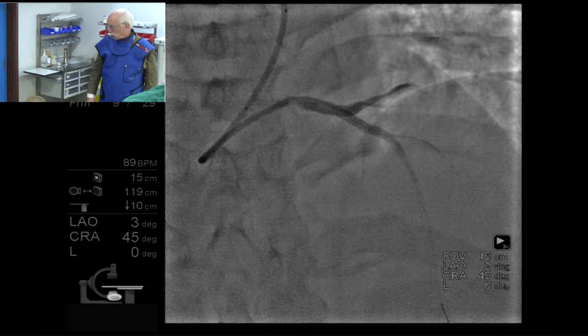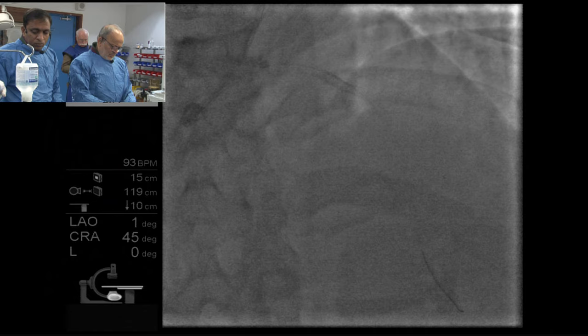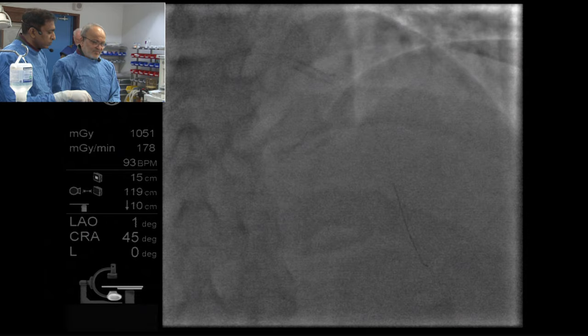Yes. There is a little plaque shift, but not bad. TIMI flow is there. Cilostazol for this guy? No, there is one lecture from Rajiv Gulati, so Sam? We have time. Yeah. Cilostazol for this guy. Okay.